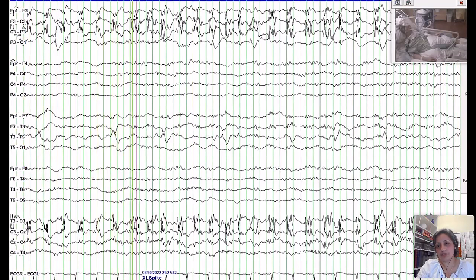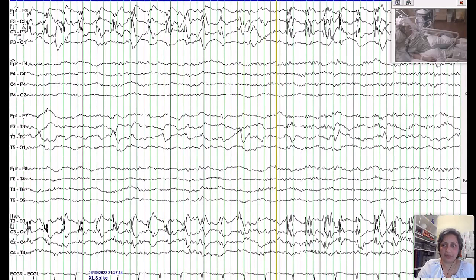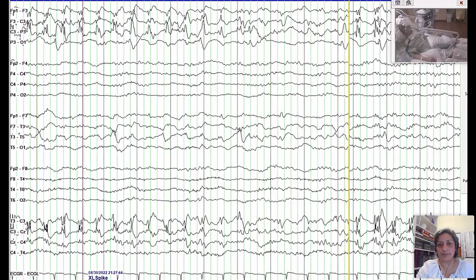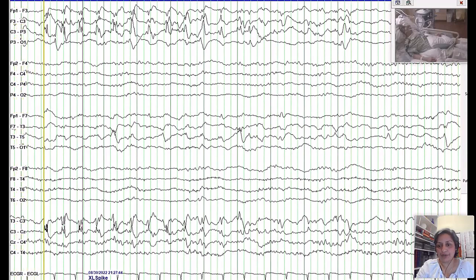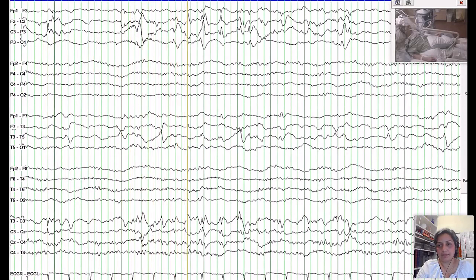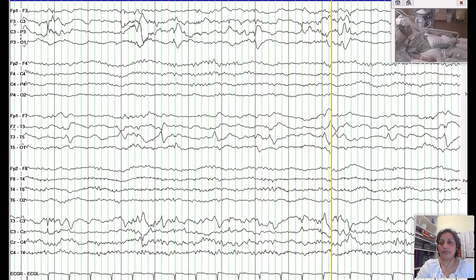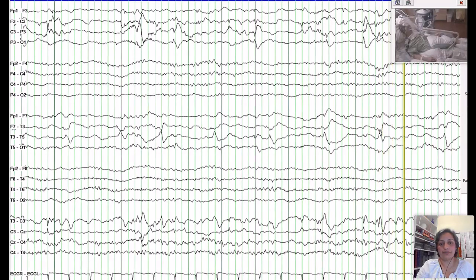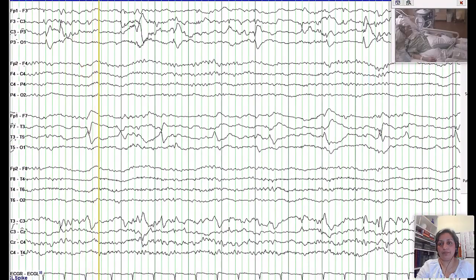This seizure could be due to a lesion in the brain or a bleed in the left central area. So almost 45 seconds to 1 minute long focal seizure. Right, a few more seconds. Let's go back to our slides here.